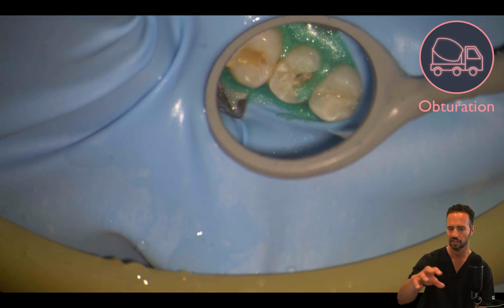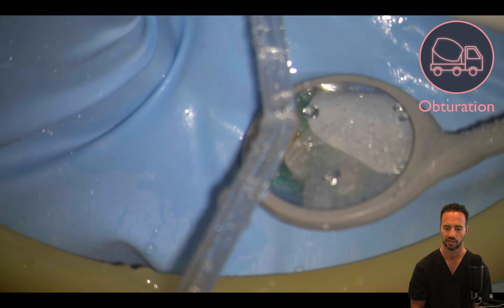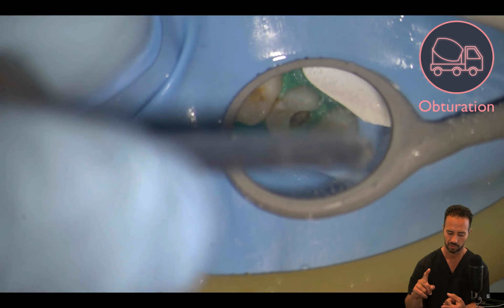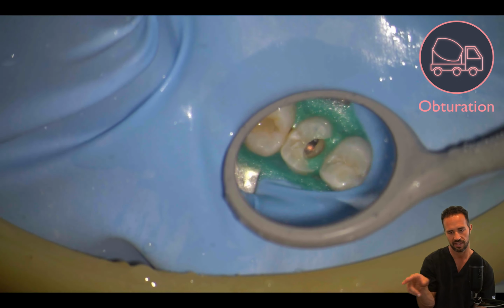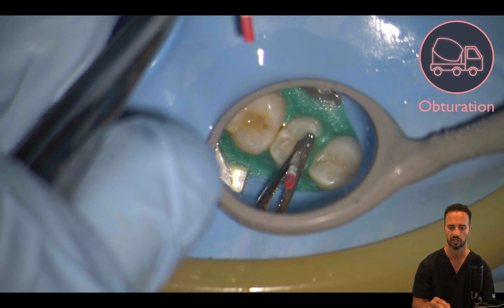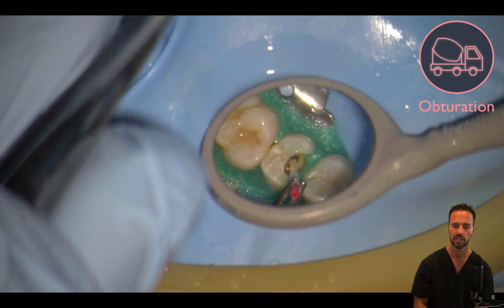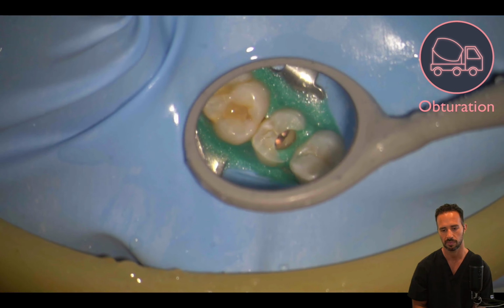But sometimes you have that gutta percha along the walls, and it can be a little bit tricky or annoying to get it all out. You can use your Buchanan pluggers, you can use an Endo Explorer, whatever it takes to kind of snake in there and make sure there's no gutta percha internally on the walls. And then for drying the post space, I will always use a paper point. So just kind of jostle a paper point in there just to get a nice dry post space.